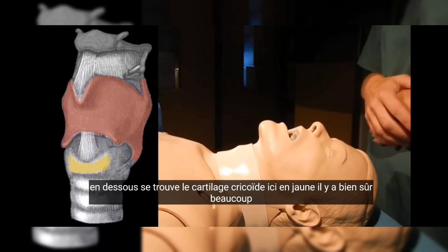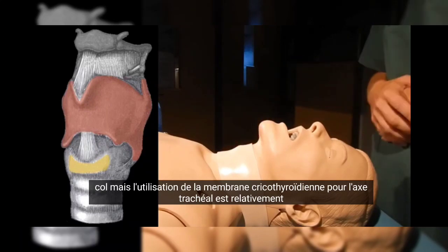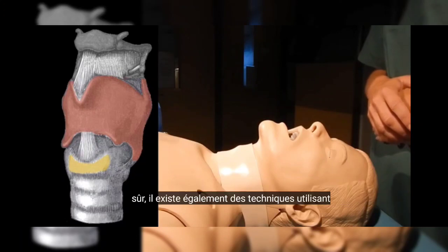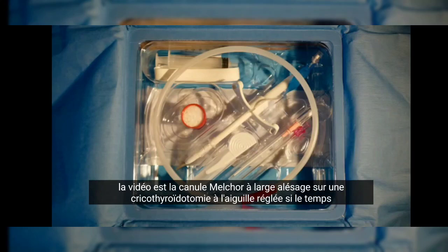There are of course many important vascular and anatomical structures in the anterior part of the neck, but the use of the cricothyroid membrane for tracheal access is relatively safe. There are also techniques using ultrasound which may further facilitate orientation. The system used in this video is the Melker wide-bore cannula over needle cricothyroidotomy set.